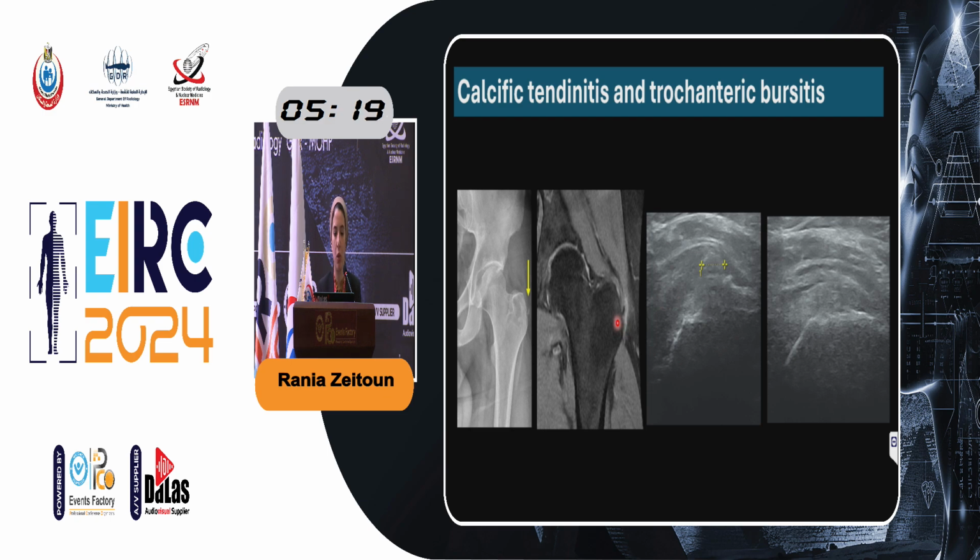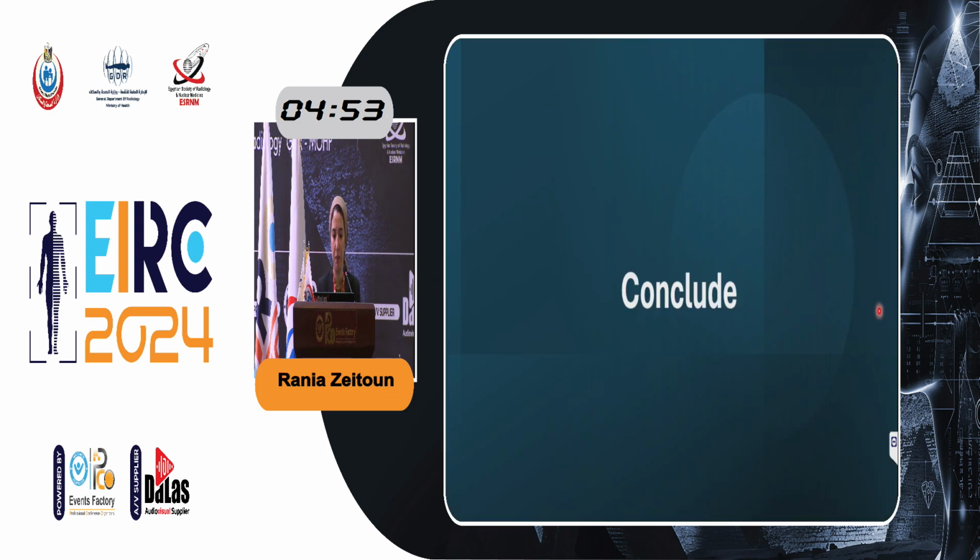Greater trochanteric pain syndrome in a patient who had gluteal tendinopathy. The tendon is thickened with high signal, and there is this low signal focus, which is calcification, calcific tendinitis, beautifully also shown on the ultrasound. And the reason we did an ultrasound for this patient is that we offered him an injection, and you can see here the bursal distension by a solution of corticosteroid and local anesthesia.